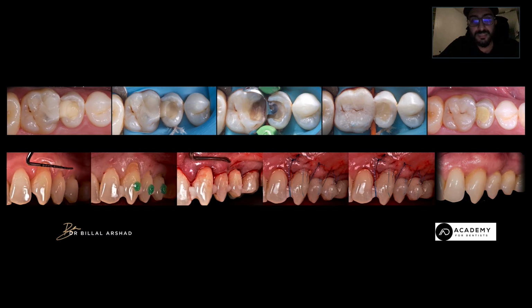The key is that you have your framing and your positioning correct. Once you have your framing and positioning correct, then everything kind of flows into place. It also improves the quality of your portfolios, and when you're looking at your own work, you realize how good or bad your work actually is.